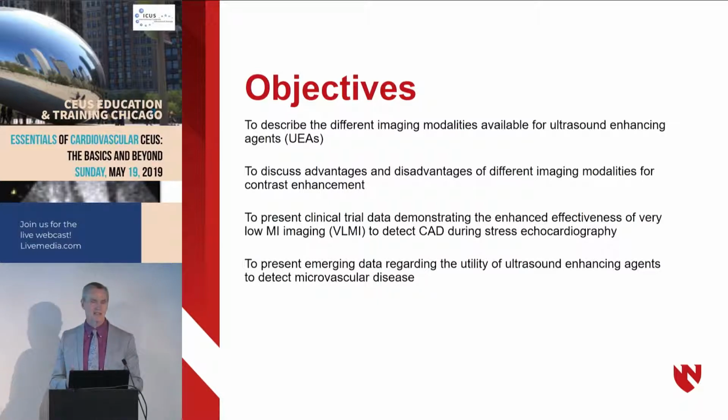We're just learning imaging techniques that are helping us do a better job of seeing the microbubbles and enhancing these borders so that we're getting true volumes, not fake volumes, at end diastole and end systole, and being a lot more confident in our interpretations of regional wall motion. And you'll be literally, I think, as I was, shocked to see some of these wall motion abnormalities that we're missing, even with what appear to be relatively good windows.